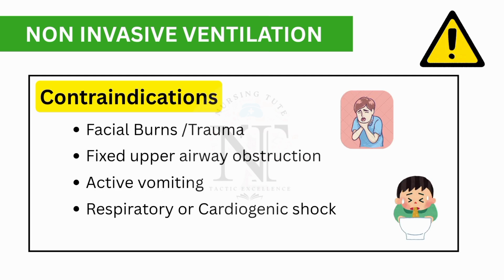Okay, and contraindications for NIV. First one is facial trauma and burns. We all know that NIV uses a mask to deliver oxygen, right? So using a mask will increase the discomfort in these patients.